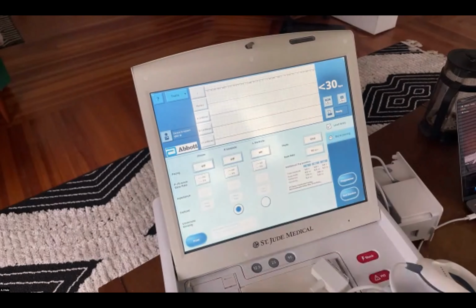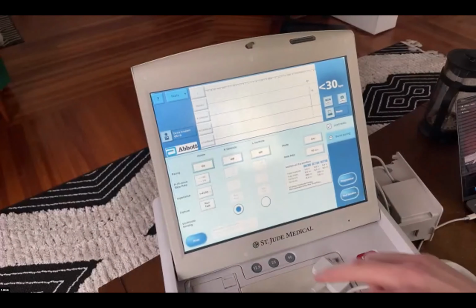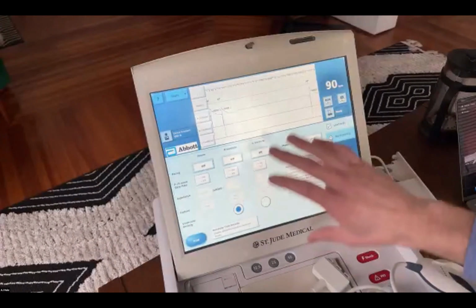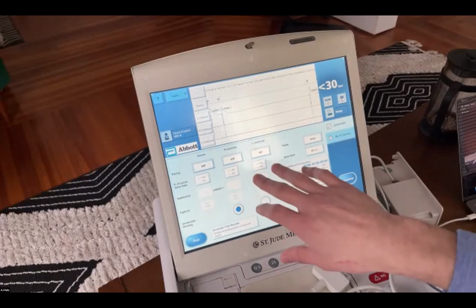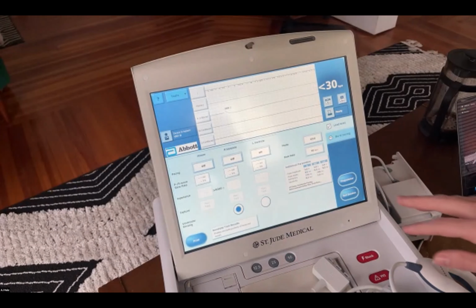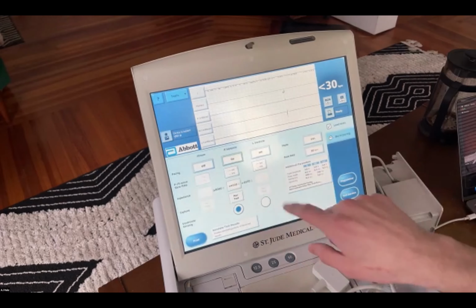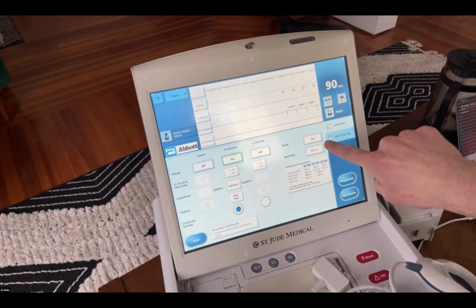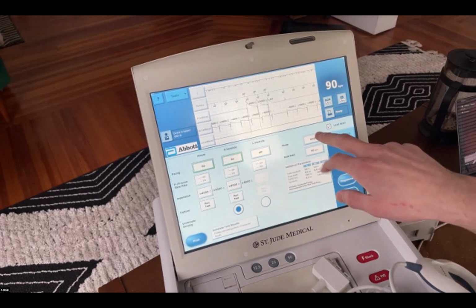Here's your PSA here. This is how you customize, as far as whether or not you want to turn pacing on or off. It's hard to do without a good example here, but a good indicator of greater than 4,000 means I'm not connected to anything. Pacing mode, you can customize the mode, but if you program it, it automatically changes the mode to VVI here. If I program it on here, it automatically changes to DDD.